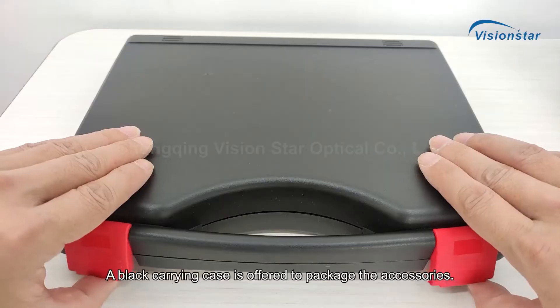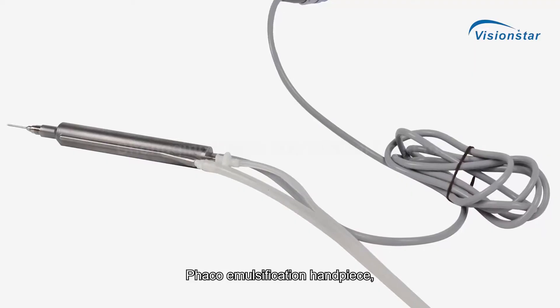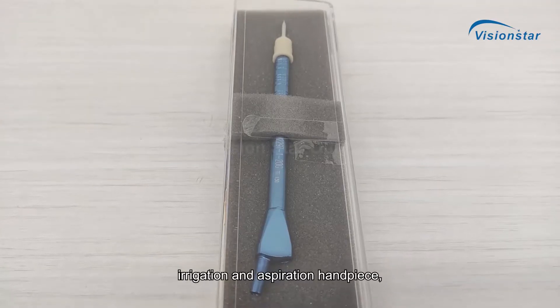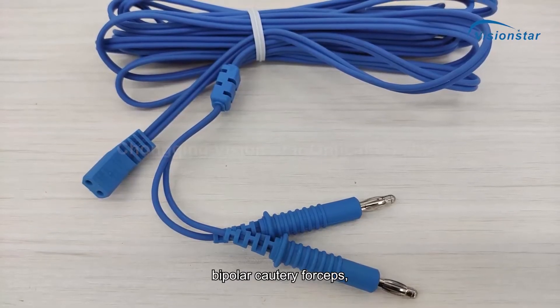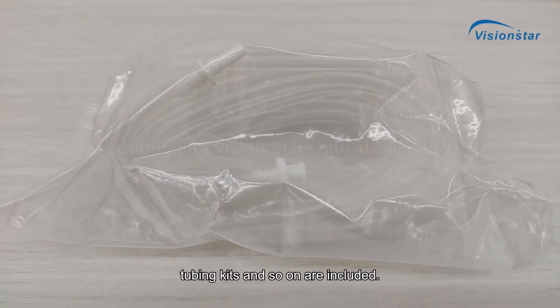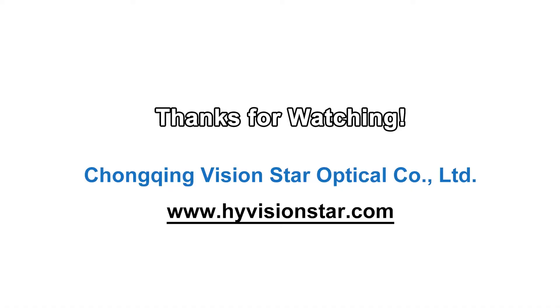A black carrying case is offered to package the accessories: FACO emulsification handpiece, irrigation and aspiration handpiece, vitreous cutter, bipolar cautery forceps, tubing kits, and a foot switch.